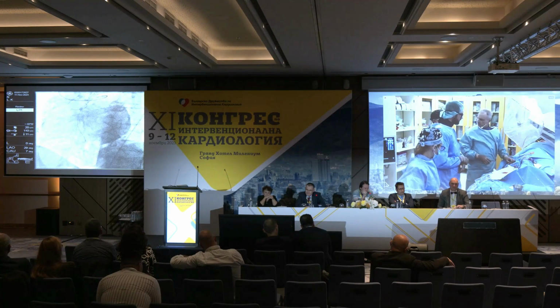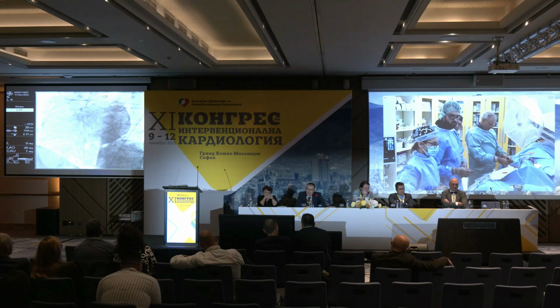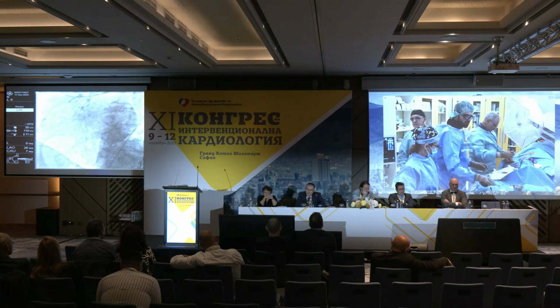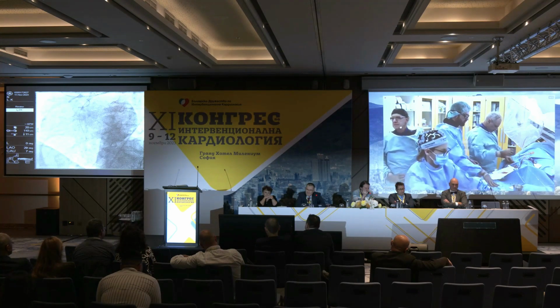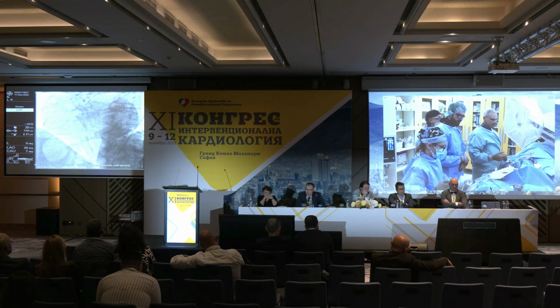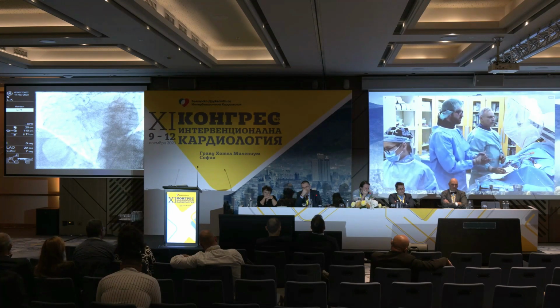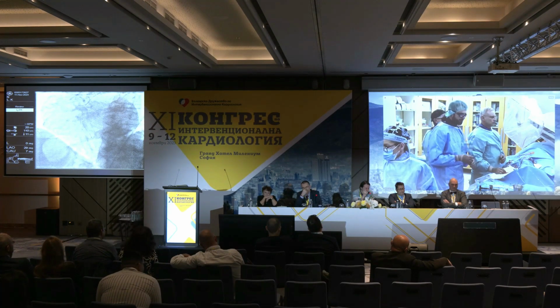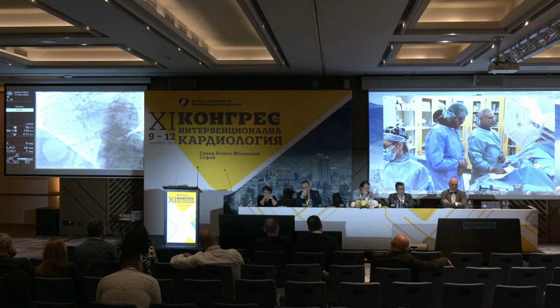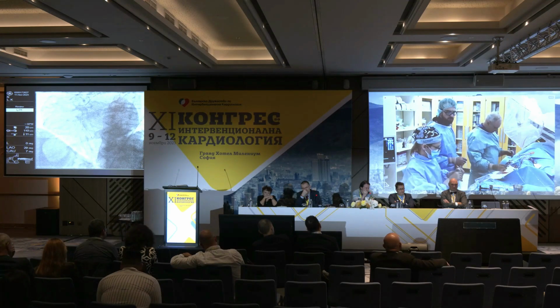Give me, Dr. Gelev, 40 by 28. Yeah. It is here. Okay. Thank you, Shevket, for this comment. It's a good way to demonstrate this technique. First of all, I'm placing the stent, then I retrieve the wire to the radiopaque tip. This might avoid giving more contrast and more radiation, because usually we stent the ostia of the right coronary artery in angles which are quite steep, 60 plus, 70 plus. Let's see how it will work now.